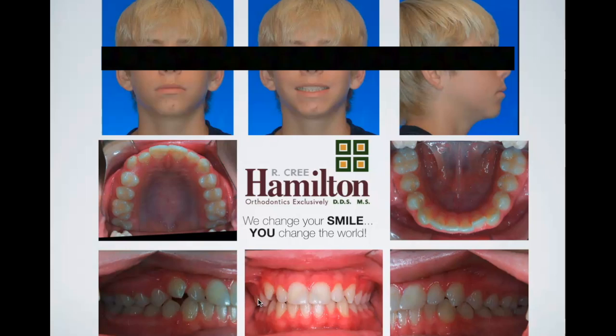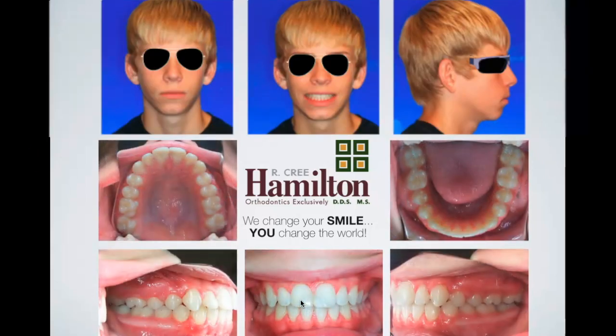If that's enough, great. If they still are lacking an incisal display and they want to have a more ideal smile, then we'll talk about placing a TAD in the anterior and bringing those teeth down further. So this was before we really did any of that. We used the wires and we got as best as we could.